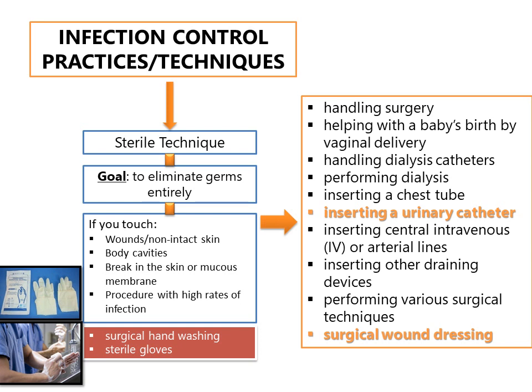Aside from surgical hand washing, in sterile technique procedures, you are required to put on your sterile gloves. I know you can see a photo of the gloves there. Normally, sterile gloves are enclosed in a sterile package, unlike clean gloves, which are just placed in a box altogether. Sterile gloves are more special. They are contained in a sterile package individually.